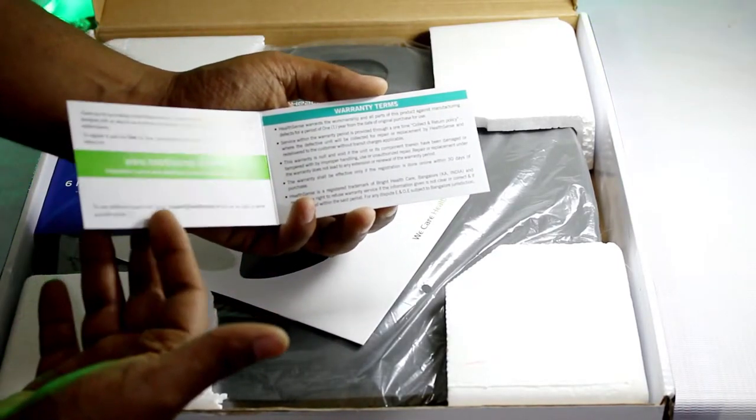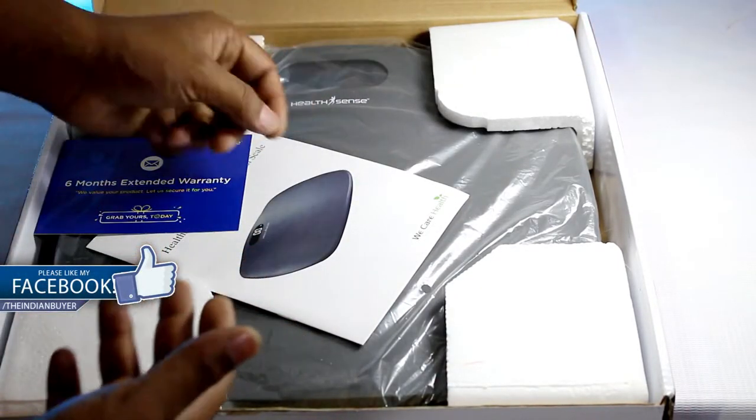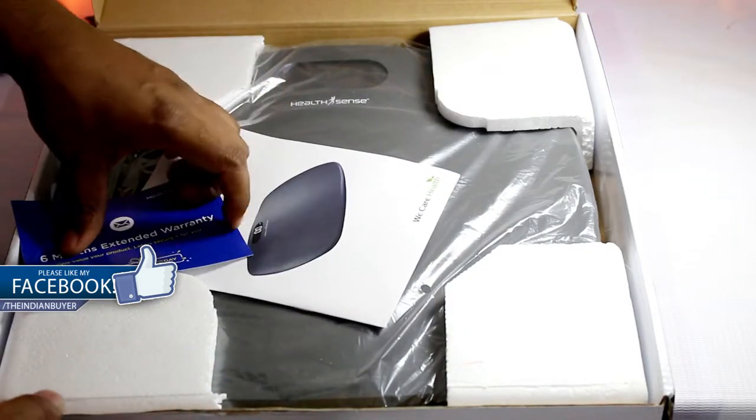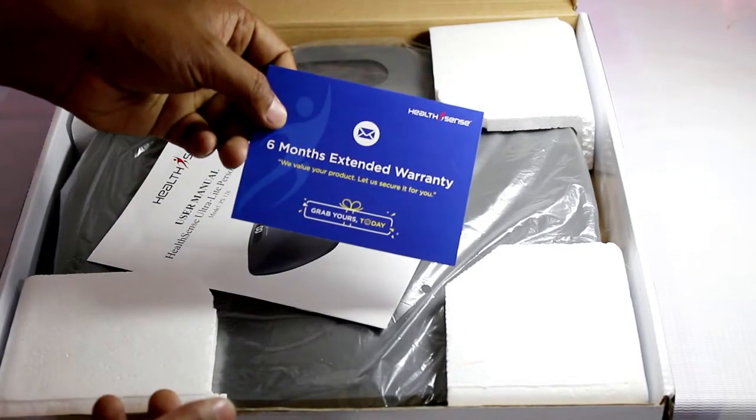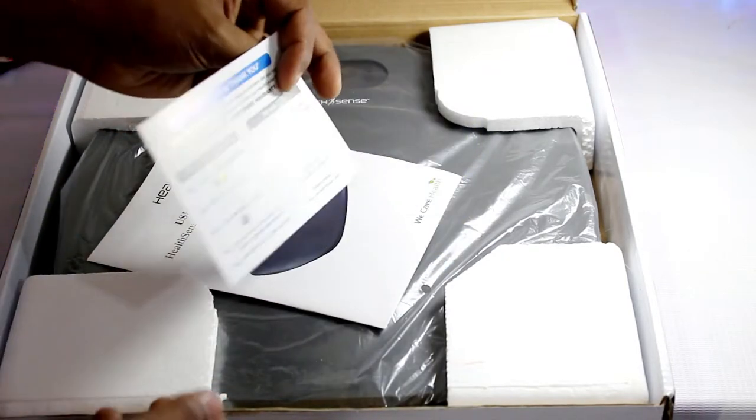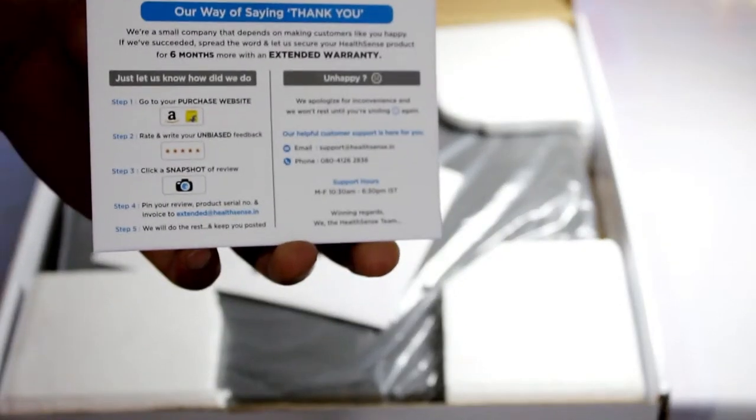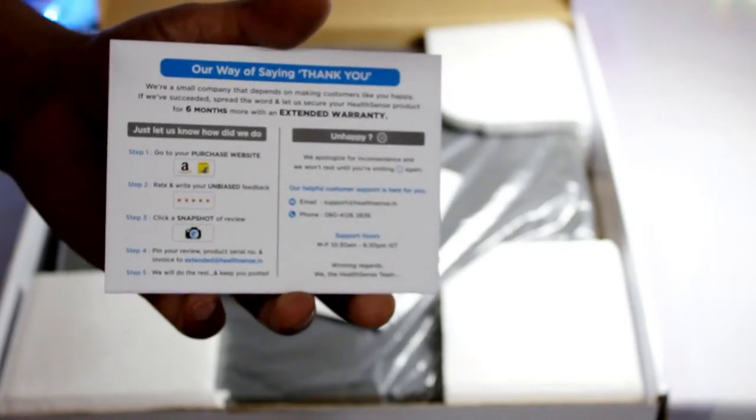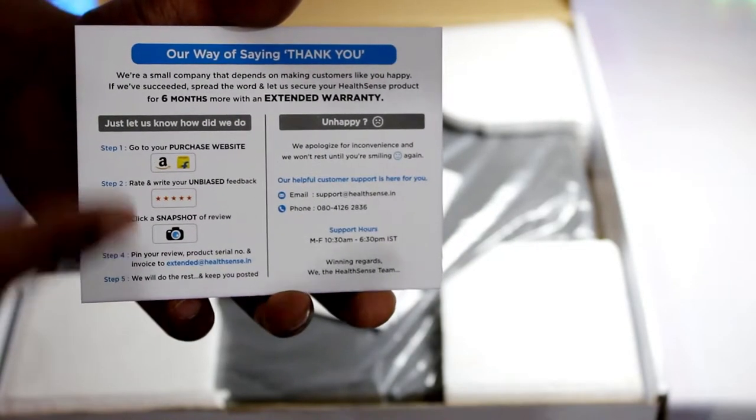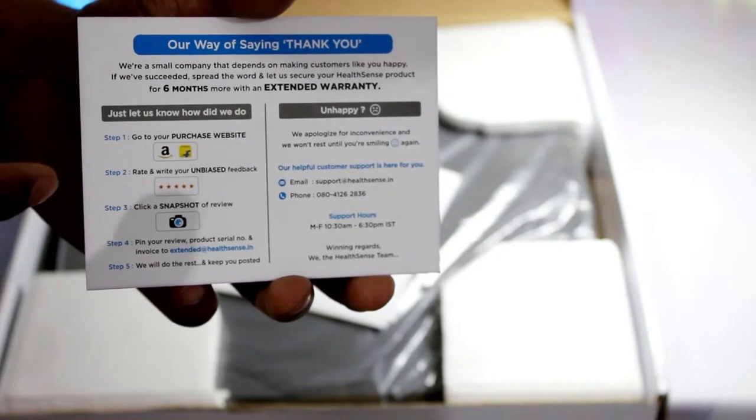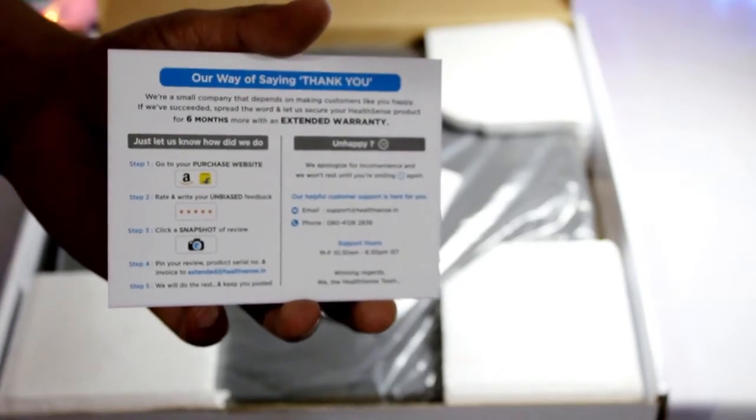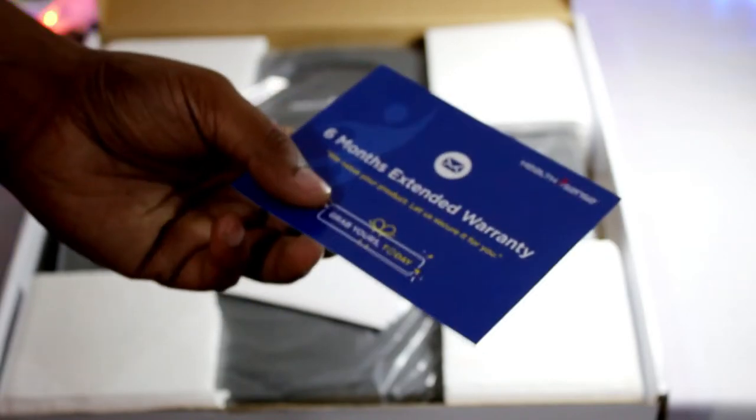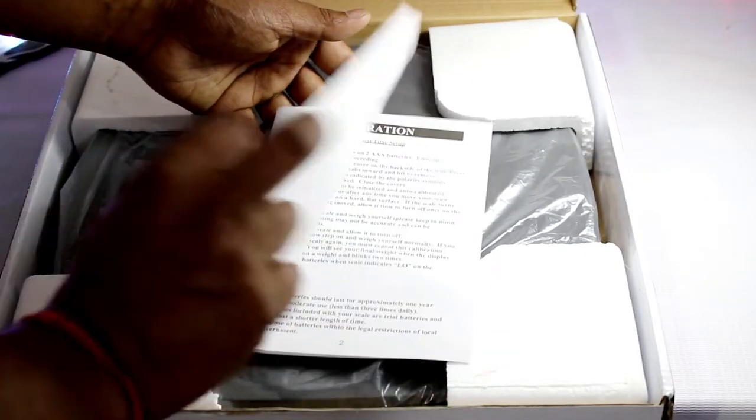Moving on, here is a warranty card. So this product comes with one year manufacturing warranty and rest of the details are mentioned over here. Now here we have a bonus of six month warranty which can be availed by the buyers if they post a review of their product along with a picture and send it to HealthSense. So it's a really nice trick to have good number of ratings on ecommerce websites like Amazon and Flipkart. But guys, if you're so desperate about this thing, at least give an unbiased feedback, that's all I can say.